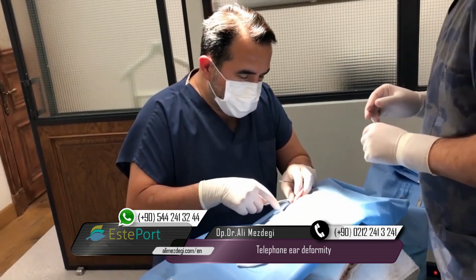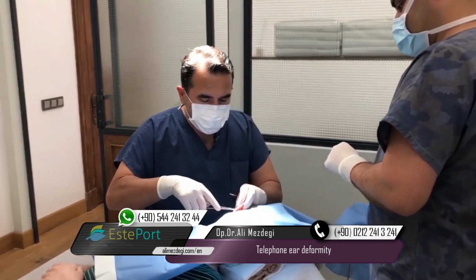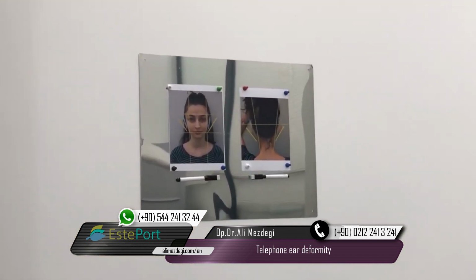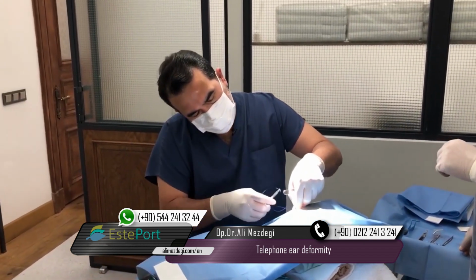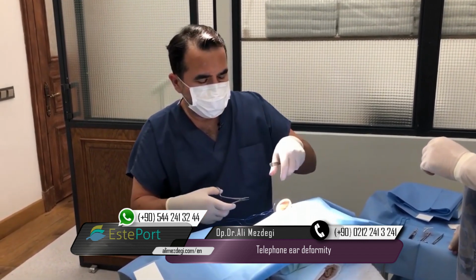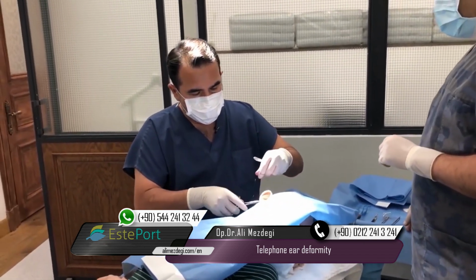Our patient, having completed the preparatory steps, we are now transitioning to the ear shaping process. While we do this shaping, keeping in mind the diagrams and illustrations from the pictures and the distance from the skull, we are progressing by organizing the shapes of the folds inside the ear. This is one of the fundamental stitches used in ear surgery.